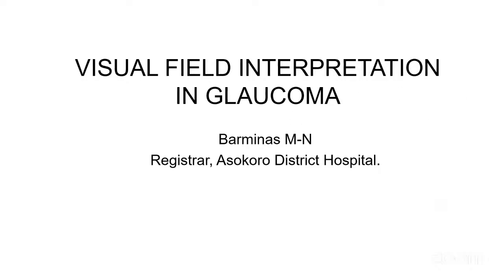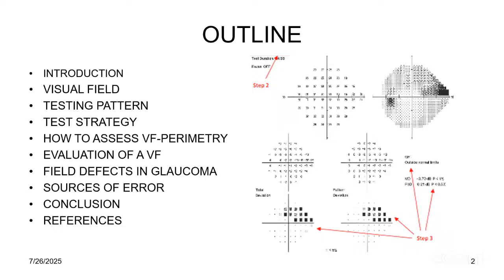I'll be doing this using the following outline: introduce the topic, the visual field testing pattern, the test strategies, how to assess a visual field, that's perimetry, evaluation of a visual field printout, the various field defects in glaucoma, sources of error, and I'll conclude and share my references.